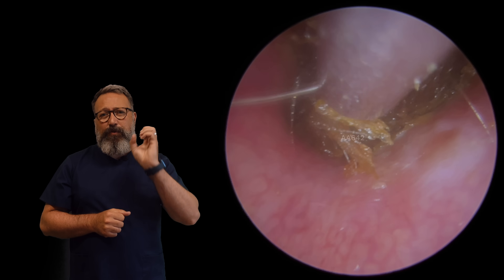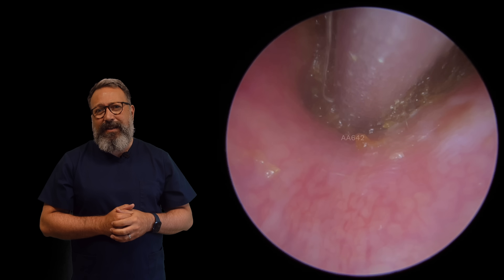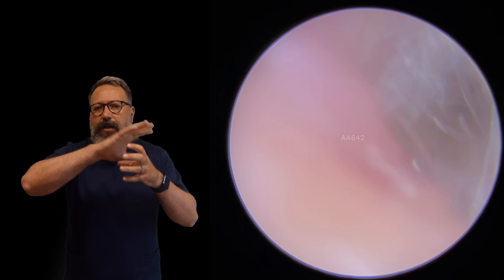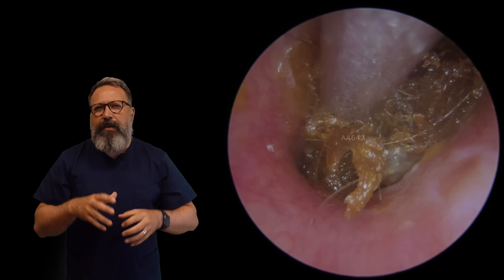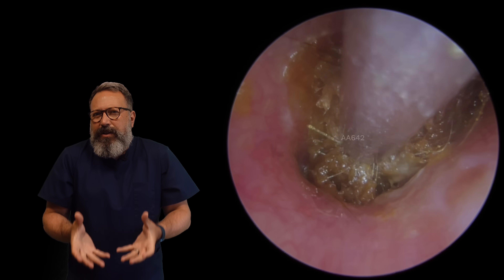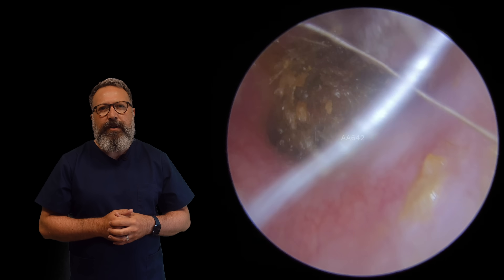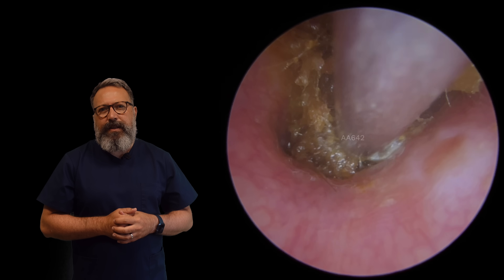Don't forget this patient has never really had their ears cleared completely — they've always been leaving something behind, and I think this is the section we're looking at here. This one is going to be a little bit impervious to wiggling, just because it's so soft — if you try and wiggle it, we'll detach the front section. So I just want to clear up all those looser bits on the front. We need to get a good suction grip in there, so we're just clearing everything from the front, trying to lift this out of the recess.